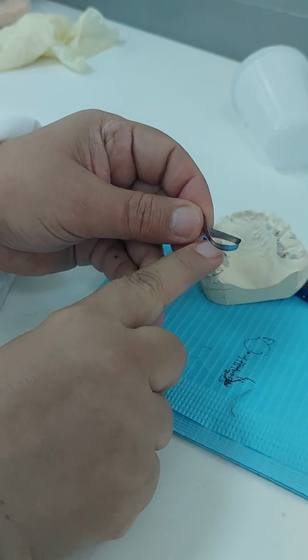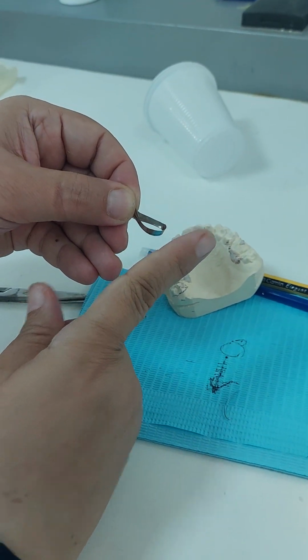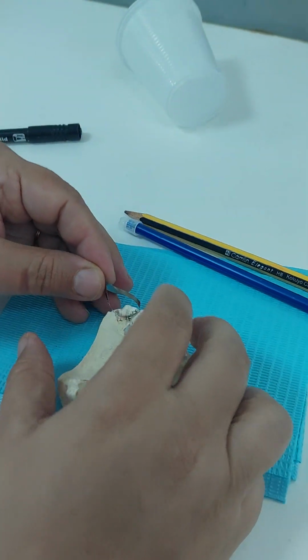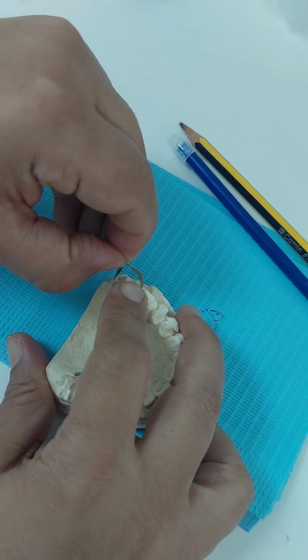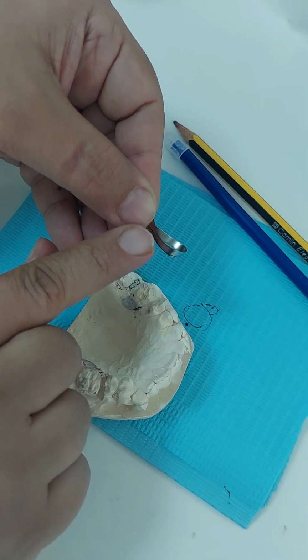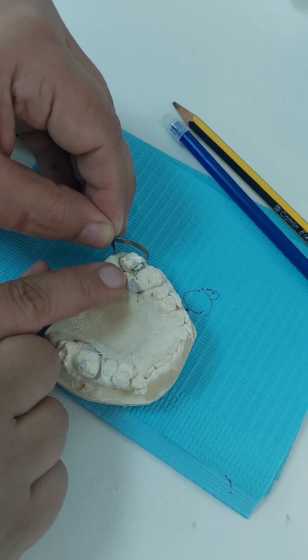See the emergence profile from the tooth? It will go outwards. But see, it also doesn't cover more than just 2 to 3 millimeters from the filling. So it will work, okay? It will work deep. It could go deeper. If I find that this is interfering with the gingiva, I concave it even more.